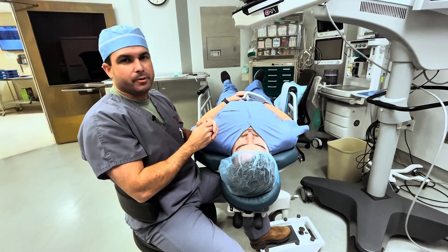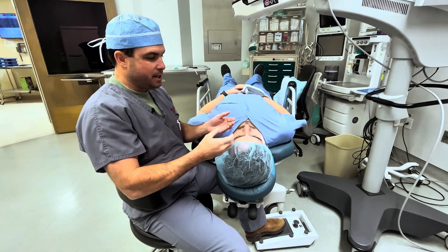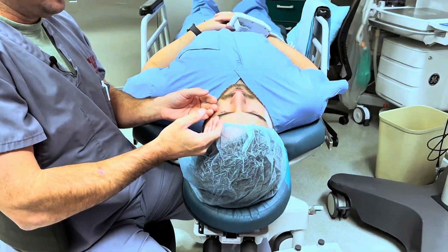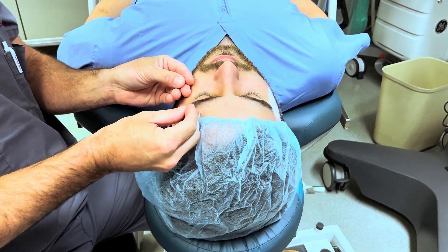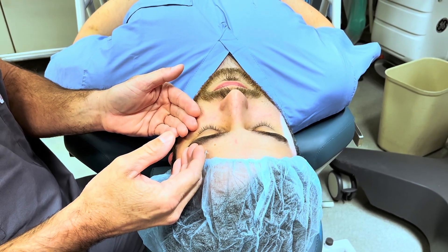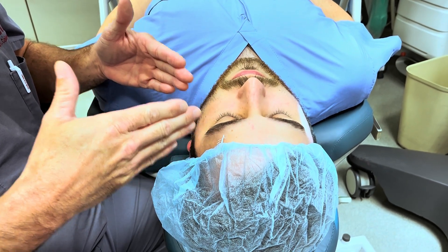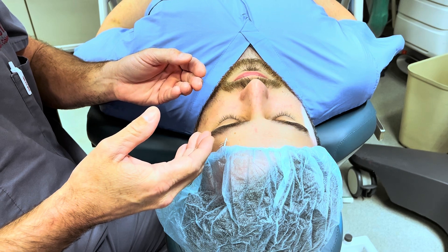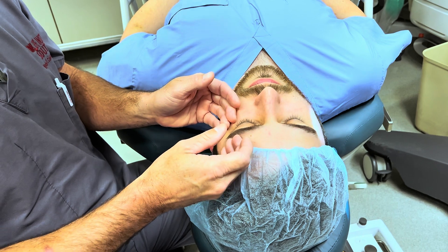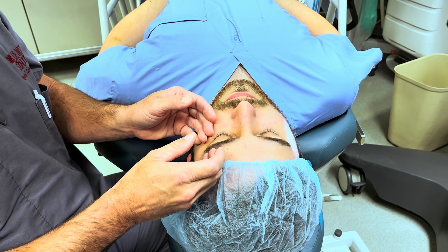When we're operating, we want as much stability as we can get — more stability comes through more surface area making contact. I like to stabilize with several fingers on the head in a supinated position, holding the instruments between my fingertips. Your main incision and your paracentesis should be about 90 degrees apart, keeping your hands in a comfortable position. Resting in a supinated position with the surface of your fingers on the head and cheek gives you more stamina to operate, do a lot of cases, and be very efficient.